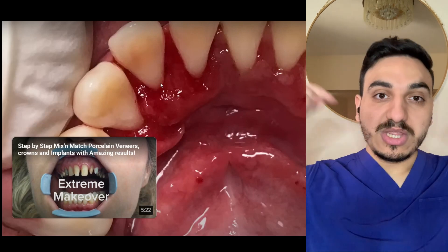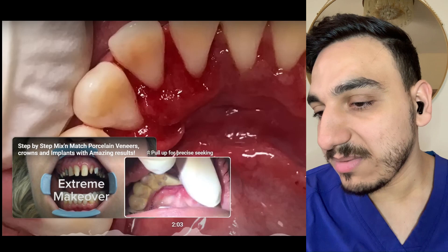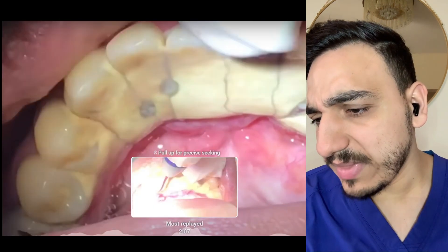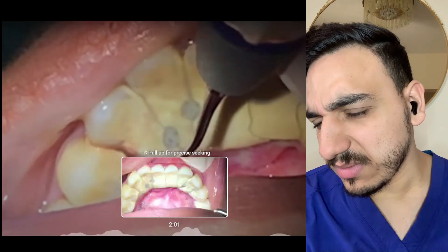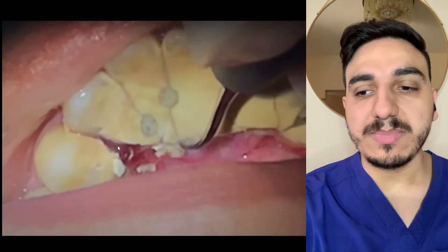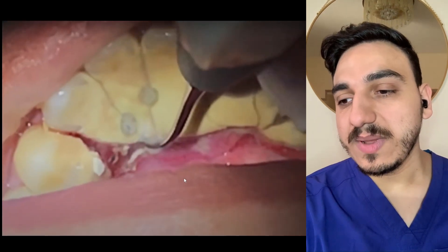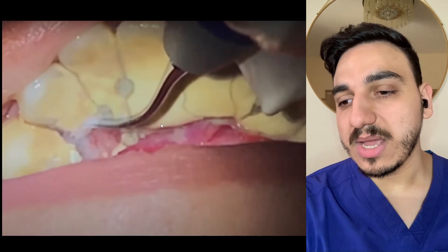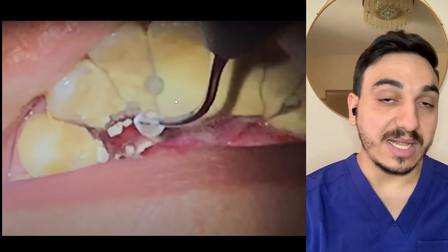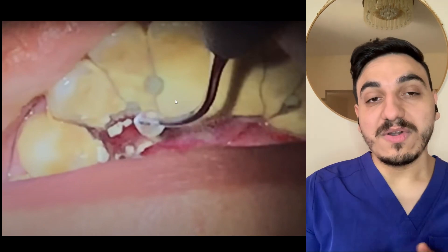This is the end result — tell me what you think in the comment section. Going back to where they started on the left side, you can see them trying to make a separation line between the calculus on some teeth, going all the way through. They're basically just trying to remove this whole bulk of dental calculus and dental tartar. Dr. Mo, dentist, was with you — thank you everyone for watching.